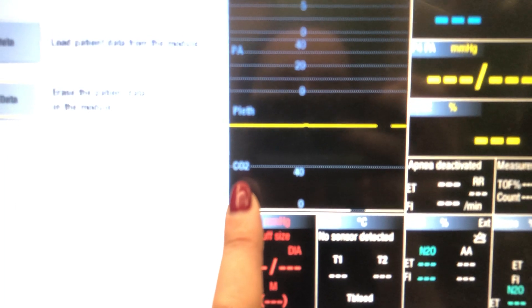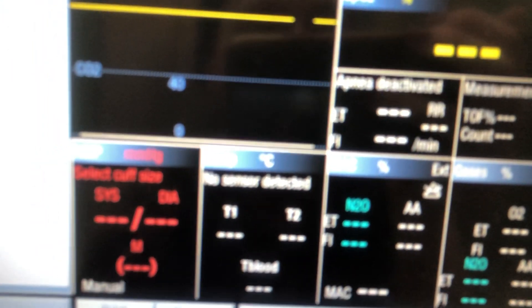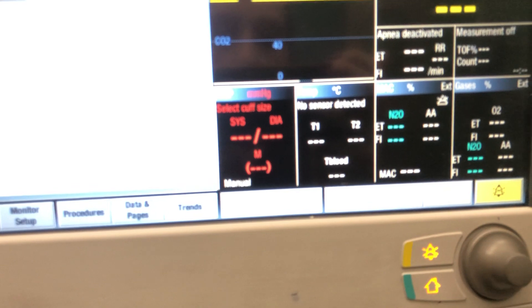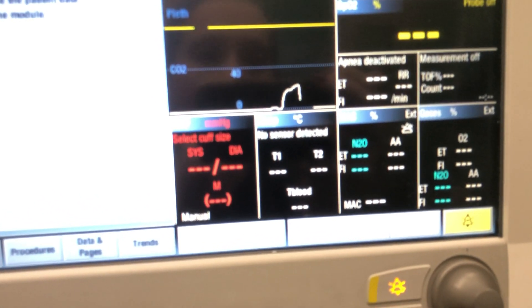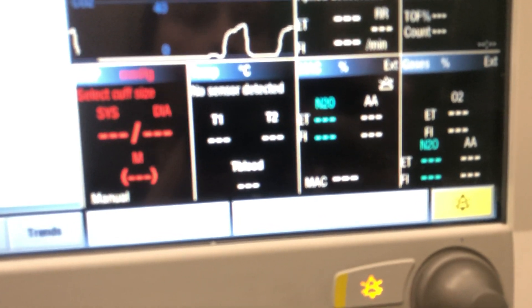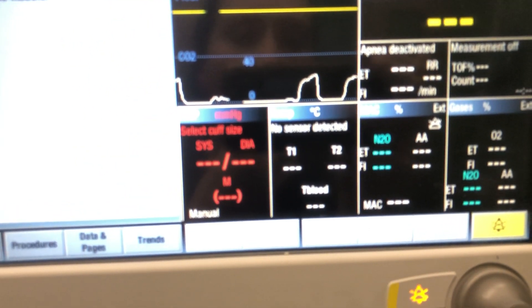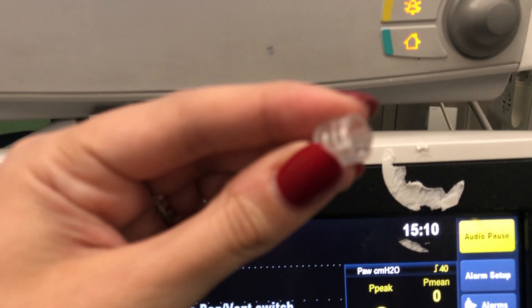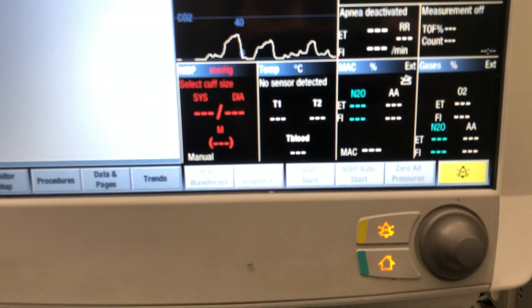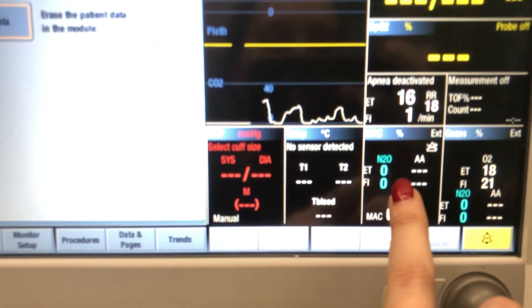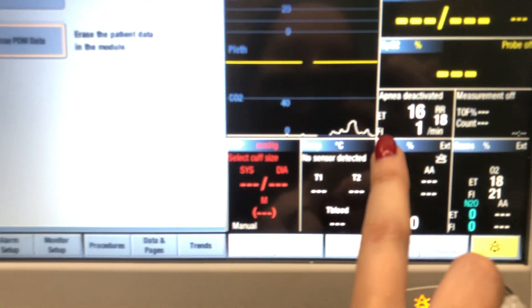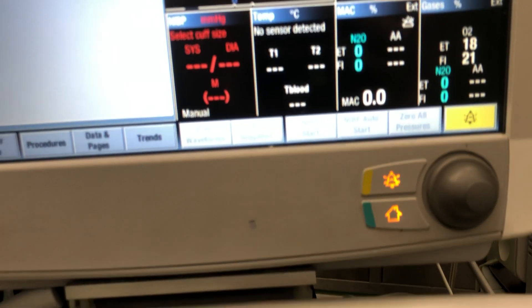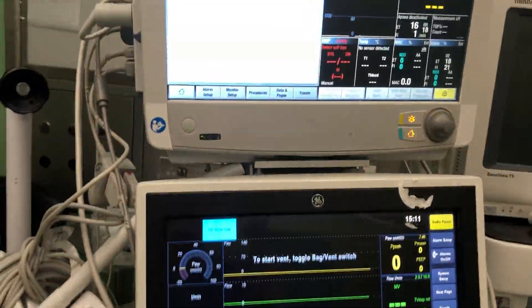The sample line also provides capnography information — you can see CO2 displayed with a waveform. You can demonstrate this by blowing into the sample line to see the CO2 waveform appear. So this small sample line gives all the information about gases going in and out of the patient, including CO2 inspired and end-tidal CO2.